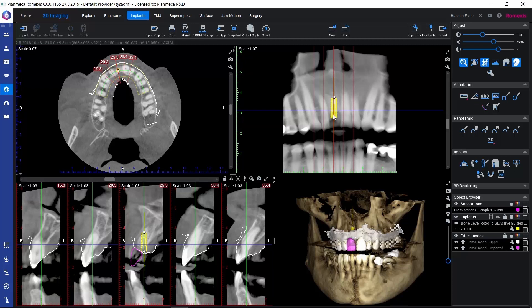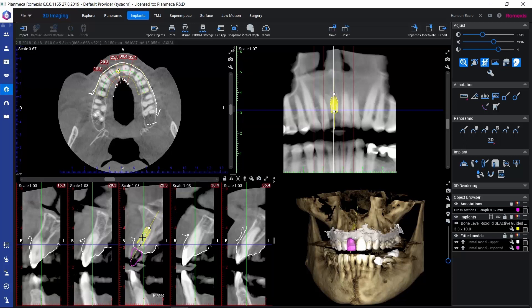Furthermore, we can reposition the implant on any of these slice views by simply grabbing it with our left mouse button and moving it around. And also, for aligning the implant, we can grab on these control points on the implant and change the angulation.